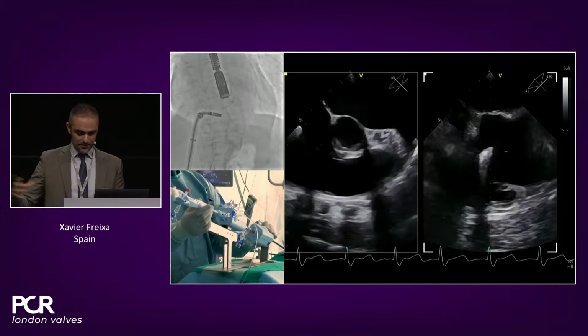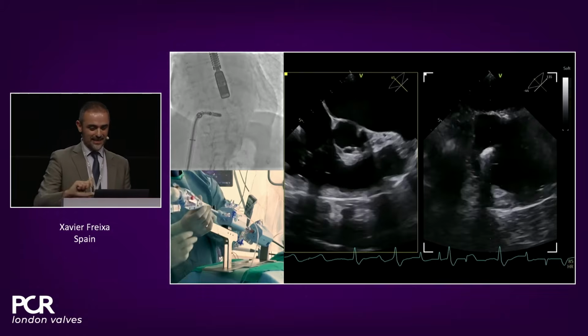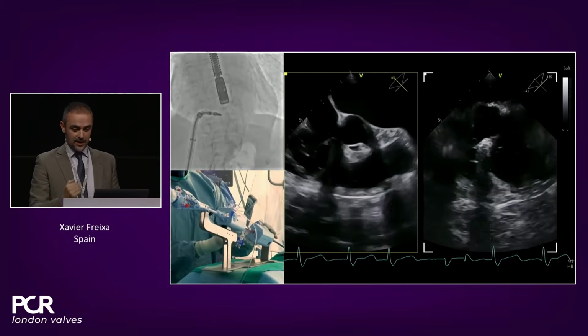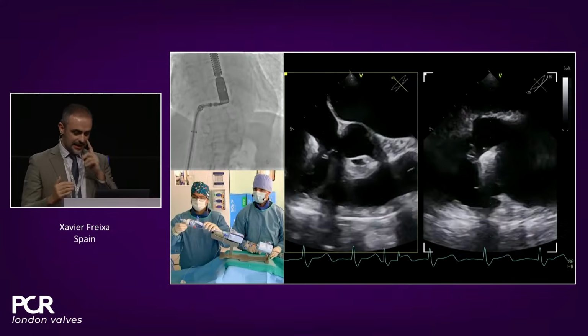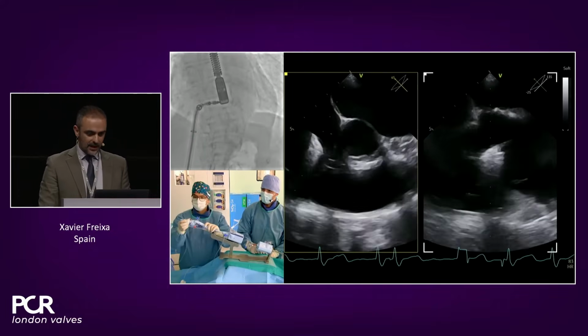So we have this super knob that it's like the septal lateral that actually, as you can see, we're applying, and it's in the guiding catheter, and it gets that catheter away from the septum. So now you can see that from the left side, the inflow-outflow and the long axis, the alignment, like the approach to the valve, it's good.